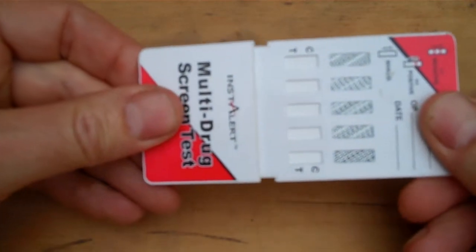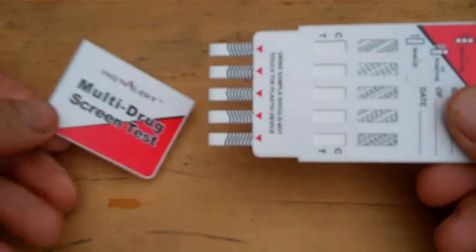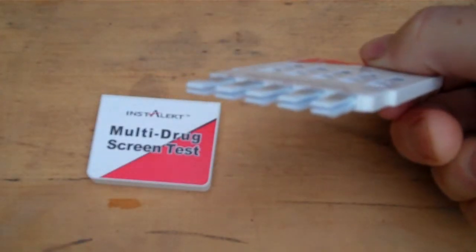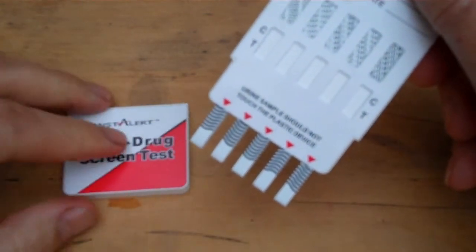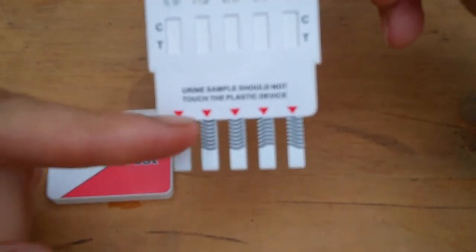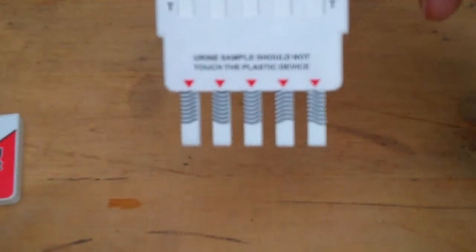And to conduct a test, very simple itself. Remove the foil cover, and there you have, if I show you this end on, in this case a set of 10 prongs coming out the base with individual wavy lines. The maximum dip line on a 10 panel and any other multi-panel is the actual base of the plastic holding, so you don't want to dip it further than that.